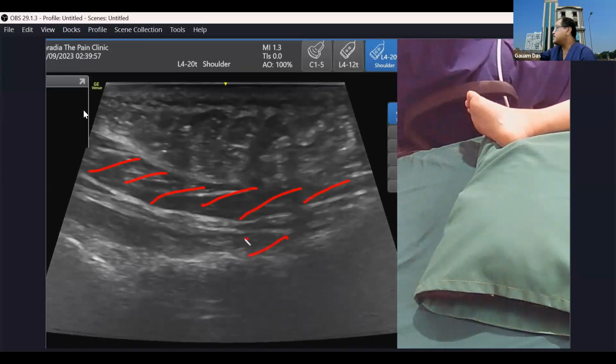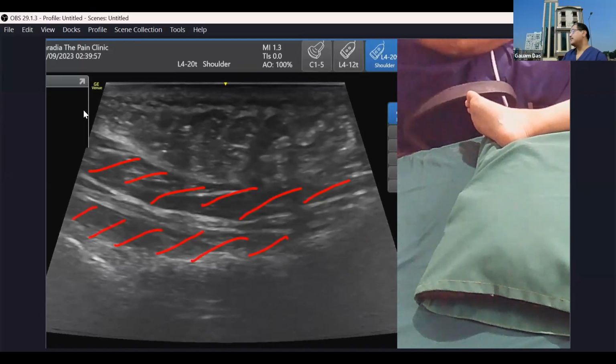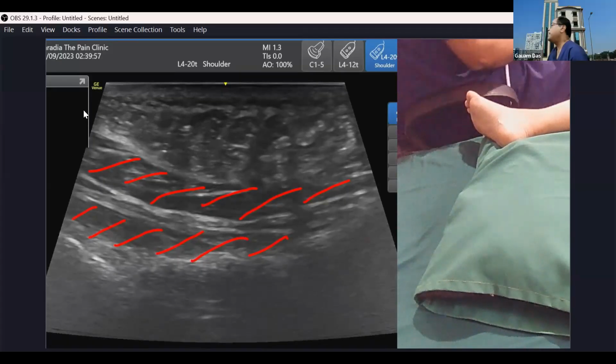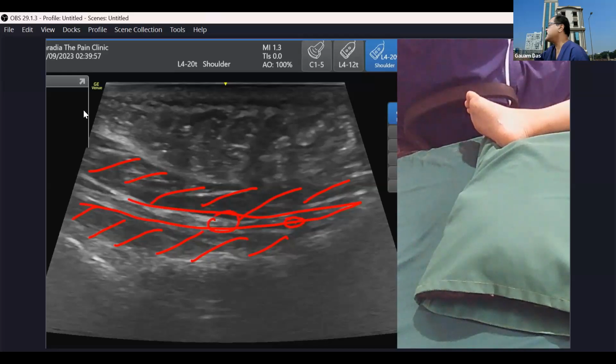And this is another muscle, the quadratus plantae. Here we will be able to see the neurovascular layer. You'll be seeing the Baxter nerve here, and the lateral plantar. Basically, the Baxter nerve is a branch from the lateral plantar, and the medial plantar is here. I'm just trying to focus on those two nerves, in between these two layers of muscle, the abductor hallucis and the quadratus plantae. Clear? So let me show you again.